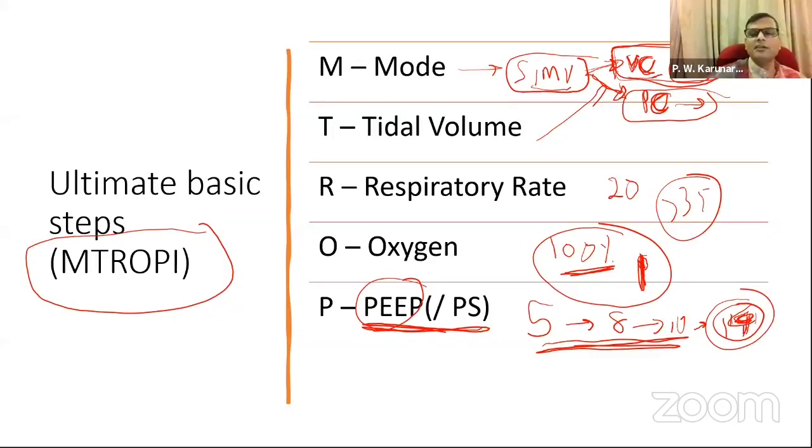If your oxygen saturation is 94% with PEEP of 8, I mean, you can recruit more lung tissue, but in the ward setup, I would not increase the PEEP more than 8, just because of a certain guideline in a non-COVID environment, the previous guideline says to have a high PEEP with high FiO2. So I would generally advise you to have a lower PEEP, but try to maintain saturation.